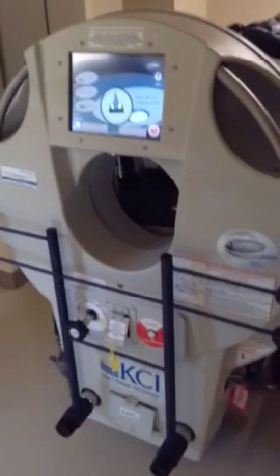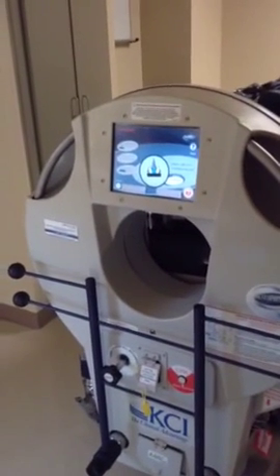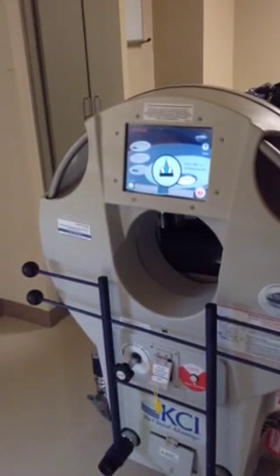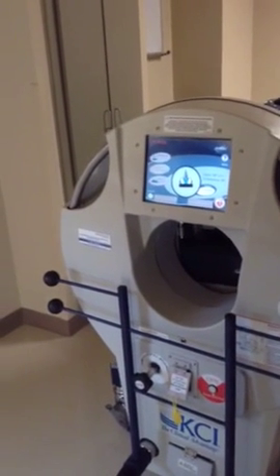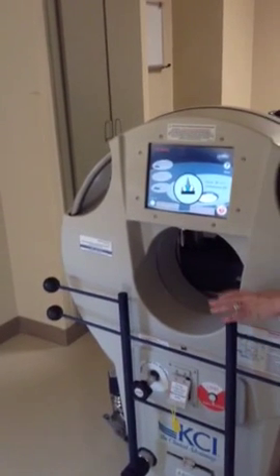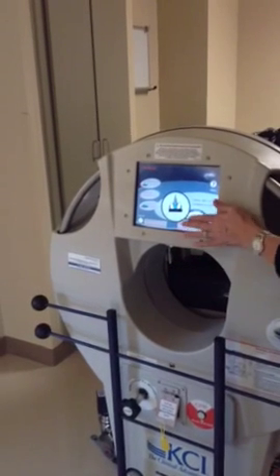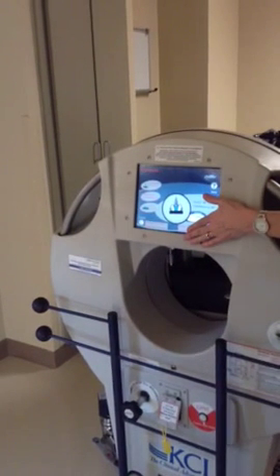Questions? Comments? Yes, sir. So going back to the CPR, when it comes to patient coding and we need to do CPR, rather than pressing the button and waiting for it to go, if the patient's secured and all the hatches are secured, wouldn't it be faster to release the bed and manually turn it? It's actually just as fast, because by the time you get down there and pull that, you could have already pushed this button. This button has the patient over in 28 seconds.